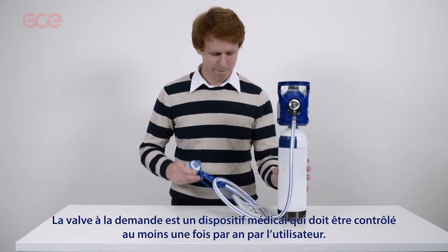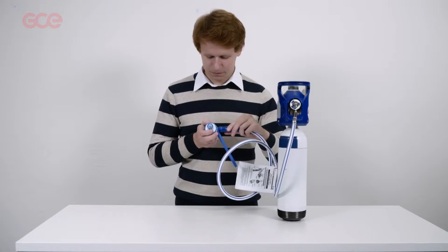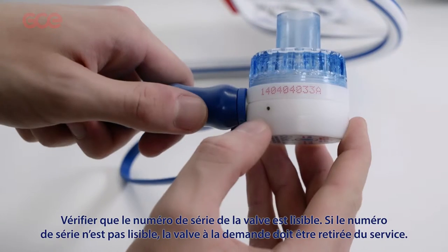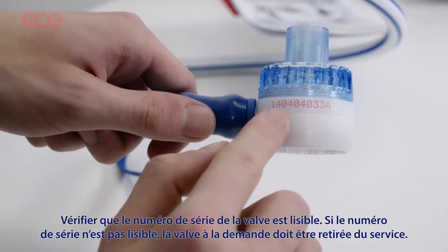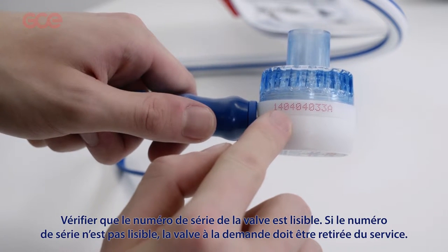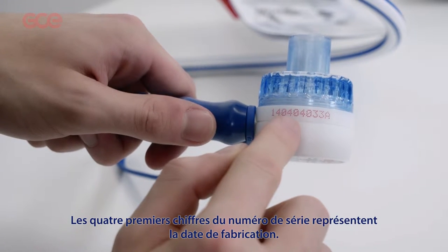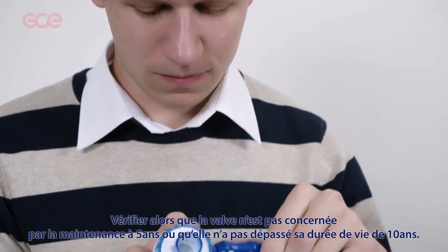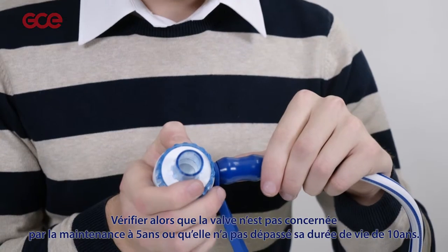The demand valve is a medical device that should be checked at least once a year by the user. Check the demand valve serial number is legible. If the serial number is not legible, the demand valve should be removed from service. The first four digits of the serial number indicate the year of manufacture. Check the demand valve is not due for a five-year service, nor has it exceeded the 10-year life period.